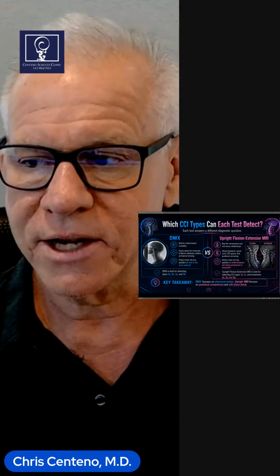Then we go to upright flexion extension MRI. Where does it really shine? It really, really shines in the type 1s. The most common type 1s out there are type 1A. That's where the head rotates too far forward and we get that very low clivoaxial angle. Another area where it shines is type 1C, and that's where you get the sliding motion happening at the skull relative to the neck.